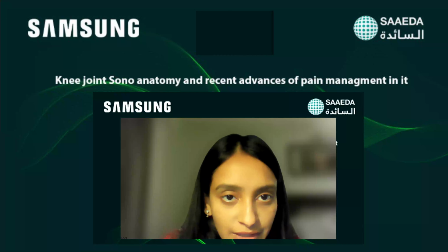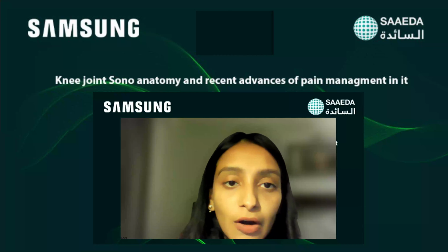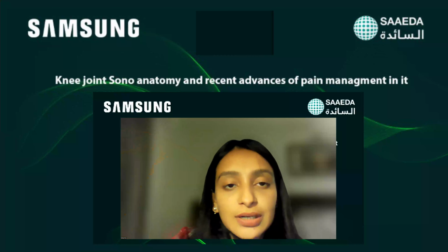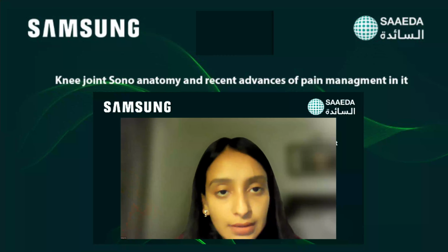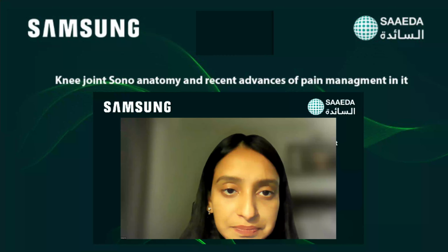I haven't observed any. And like I have mentioned, if the patient has more pain on the medial side, we will be additionally targeting the other nerves supplying the medial side and separately the lateral side. Otherwise, those three nerves are the ones that we are ablating mostly.